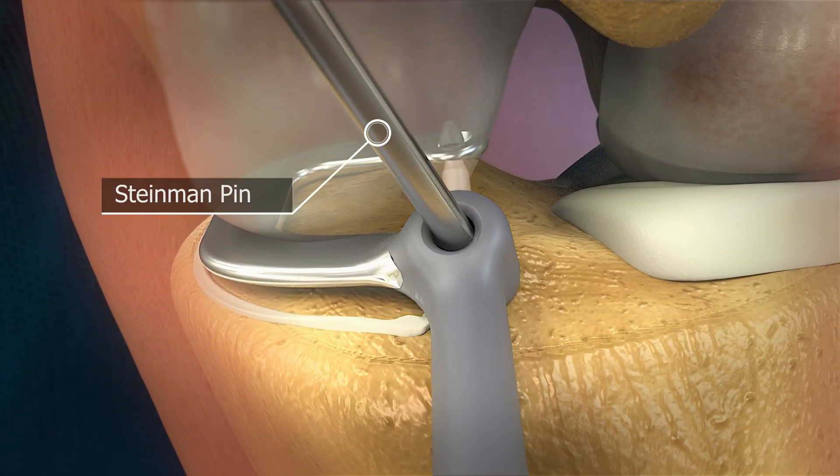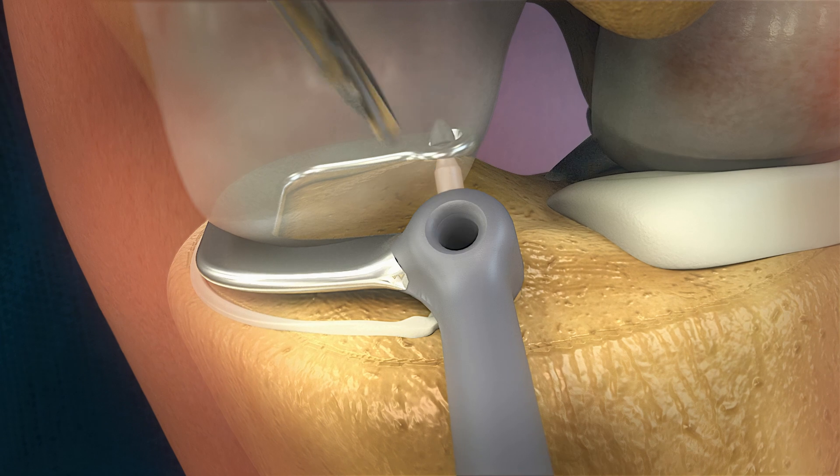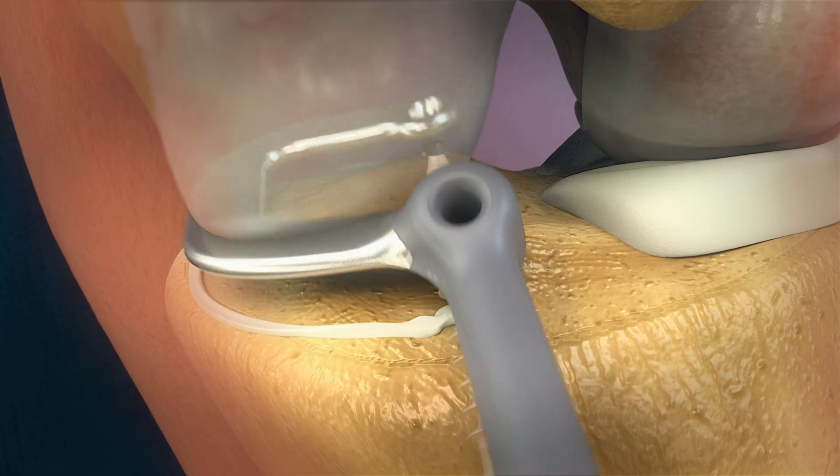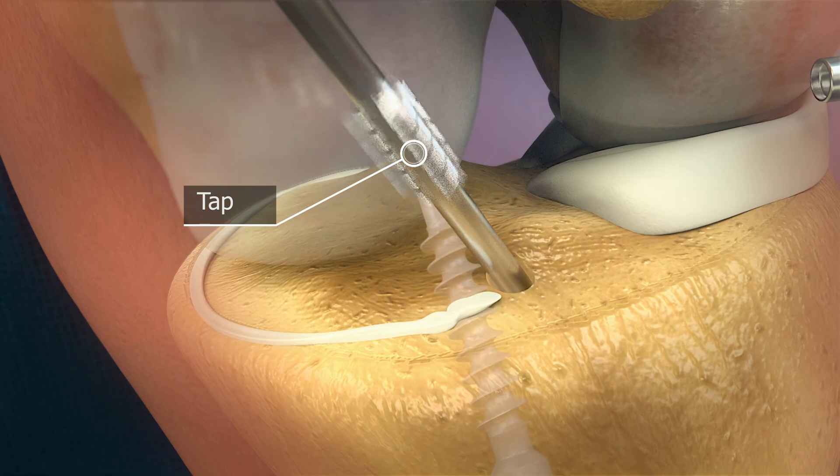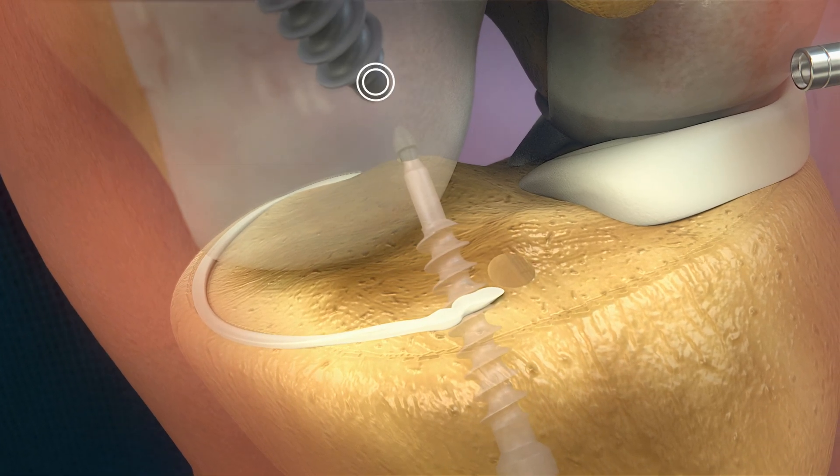The Steinmann pin can be drilled through the anterior drill hole of the trial sizer. After removing the drill and trial sizer, the hole is tapped and the anterior screw can be placed with the T-handle.